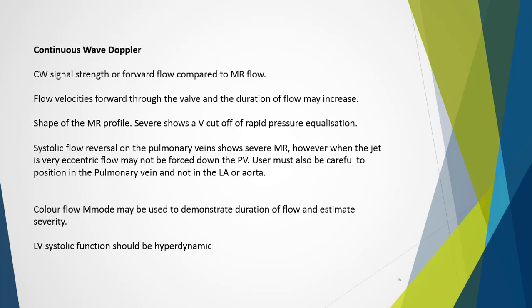Colour flow may also be used to demonstrate duration of flow and estimate severity. This method is also very useful in demonstrating diastolic mitral regurgitation, which occurs when complete heart block is present.